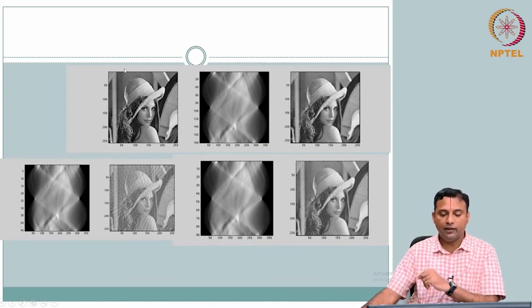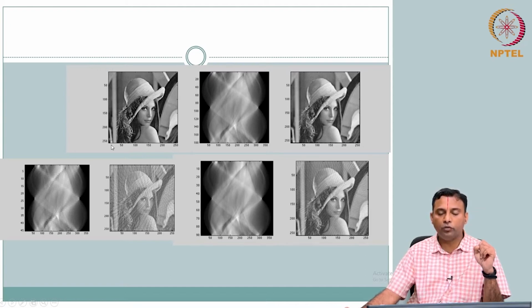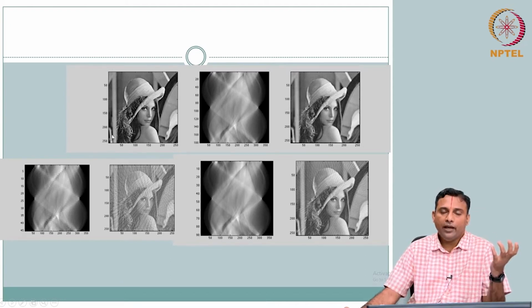If you are going to project from top down like we did for the square example, this 250 is your L, number of elements. This is 0 degree. So if I have line projection, you add all this and you get one value here. Add all this, you get another value. So you get a 250 array with 250 elements, and each value is the sum along this 250, right? So you can do that.